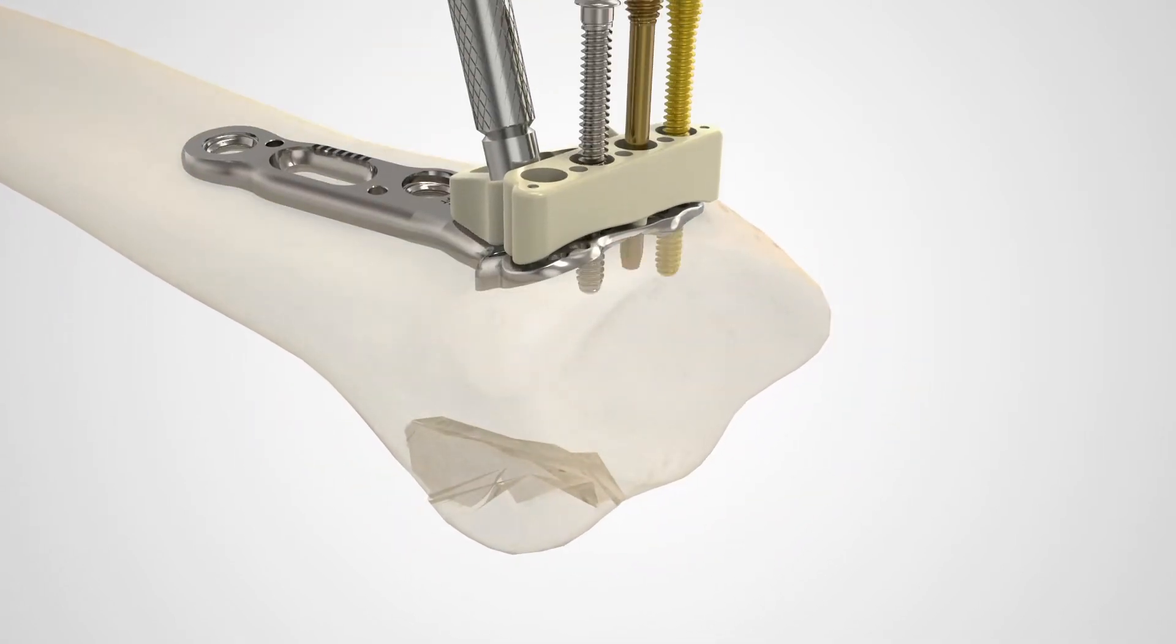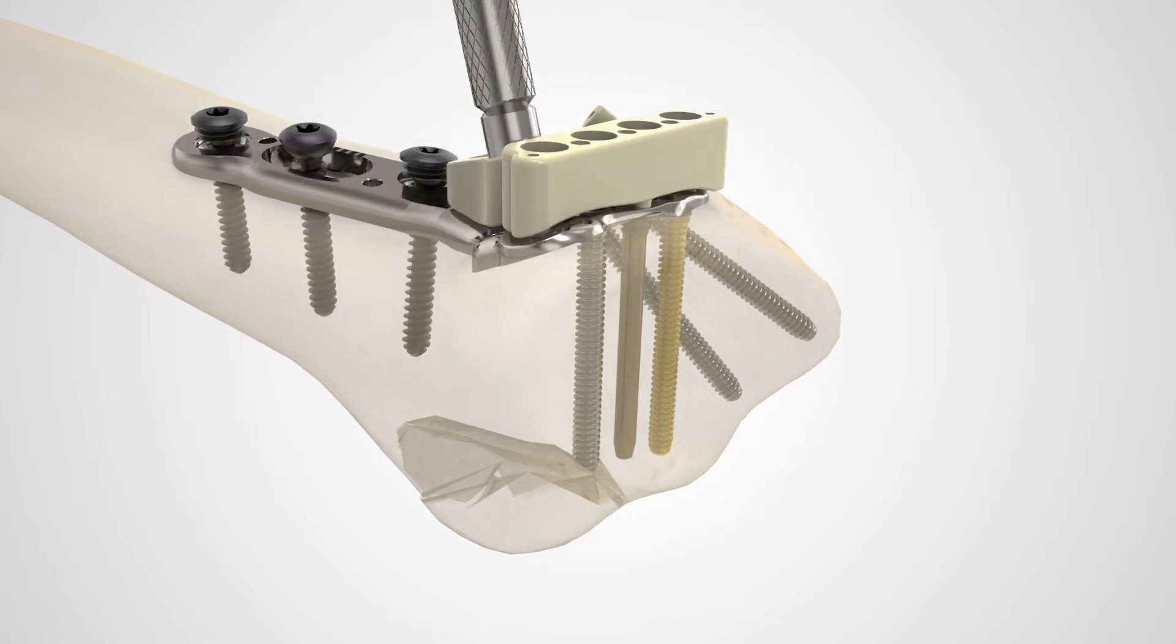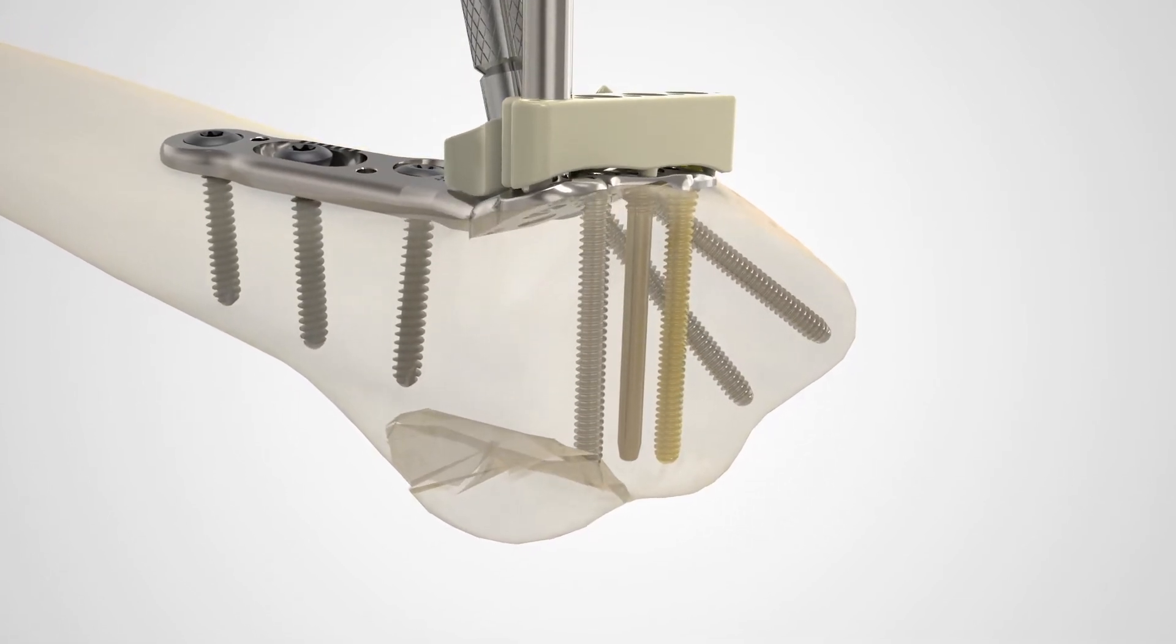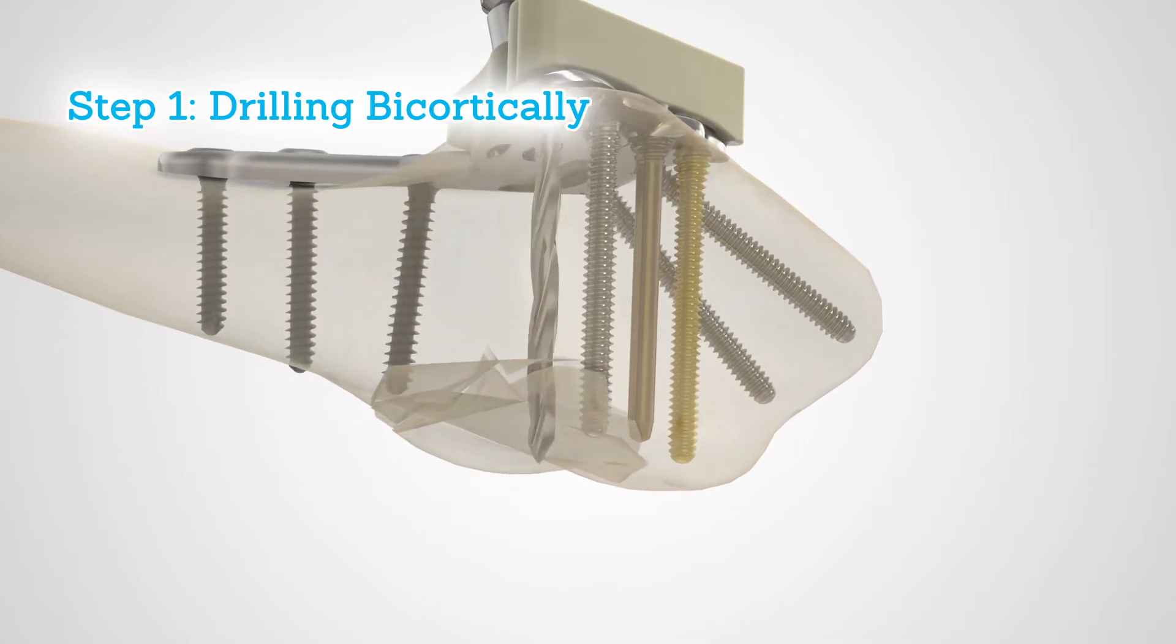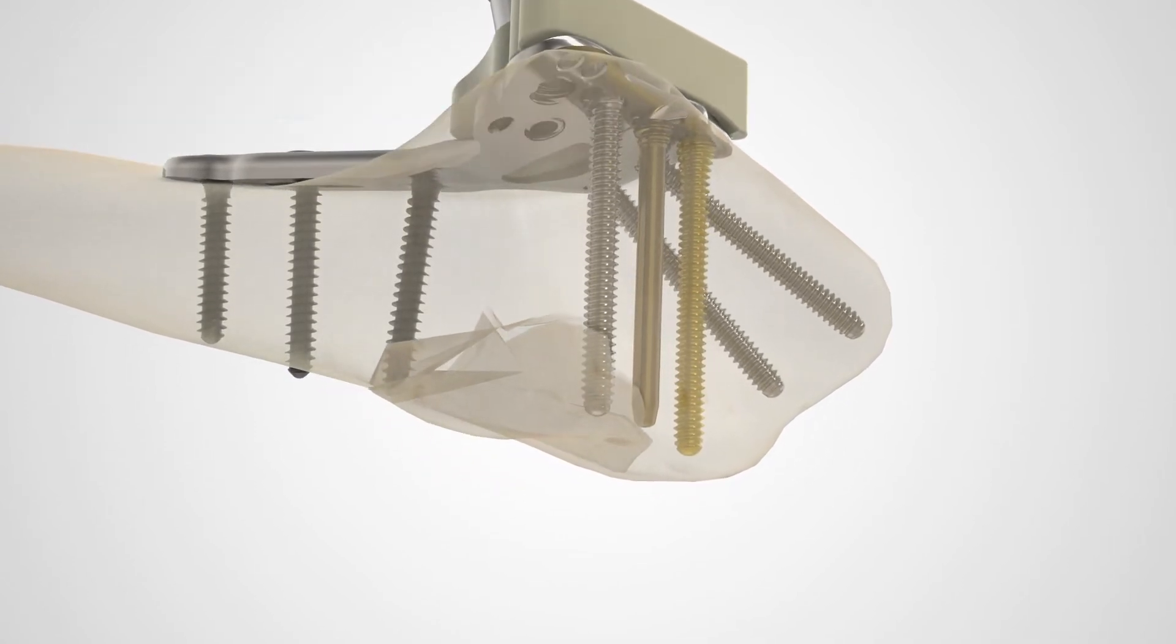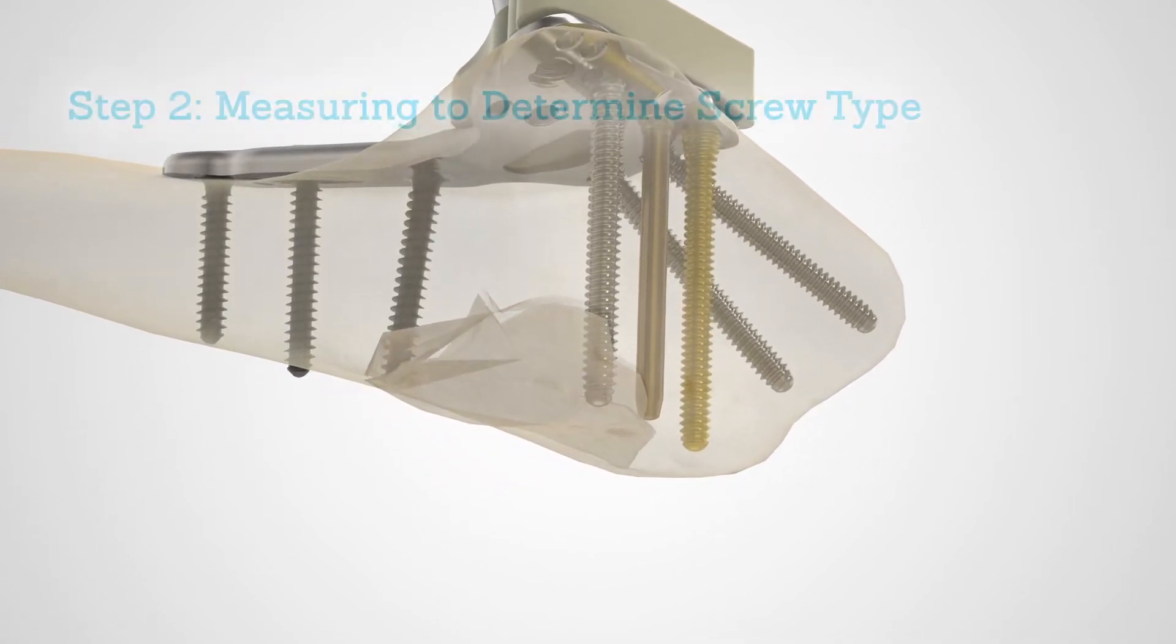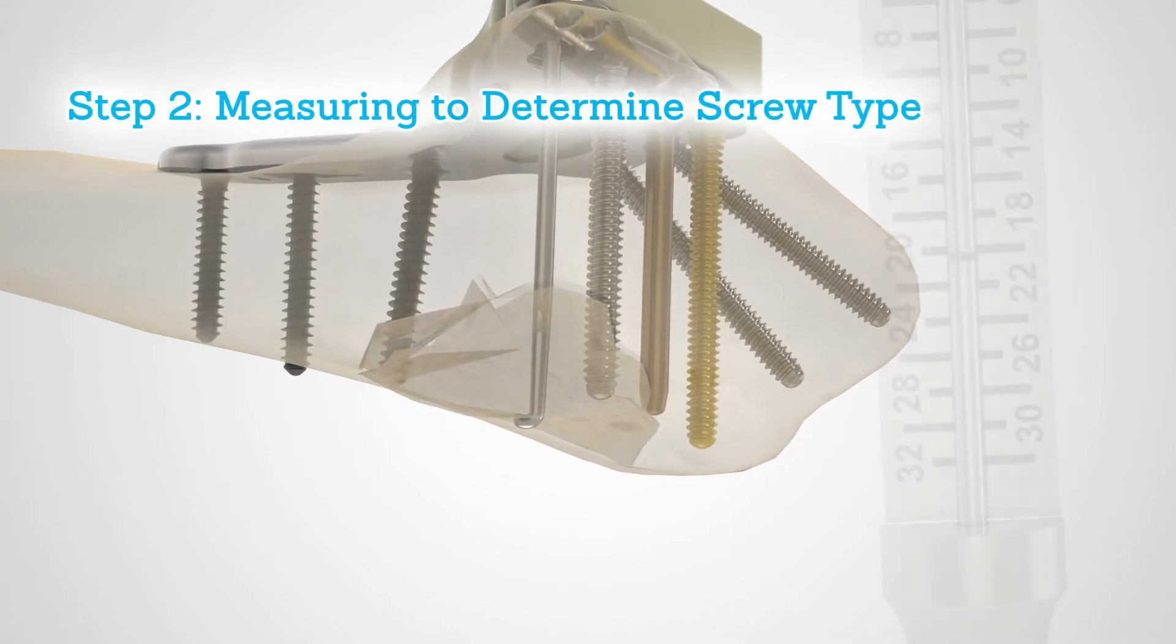After appropriate plate placement and initial screw insertion, drill bicortically with the 2.0 quick-release drill through the 2.0 drop-in drill guide or locking drill guide. Measure the screw length using the distal radius probe.